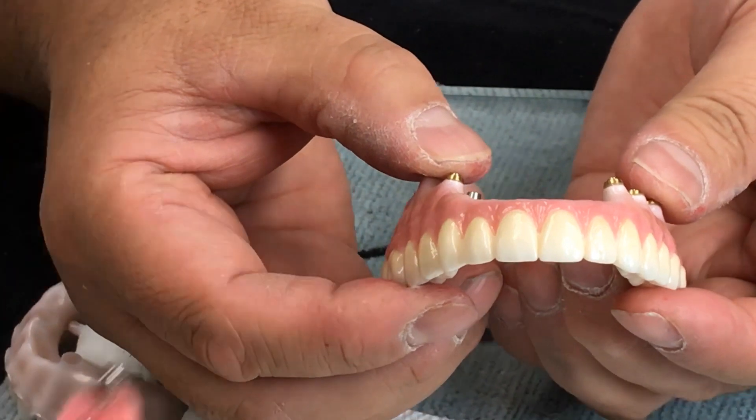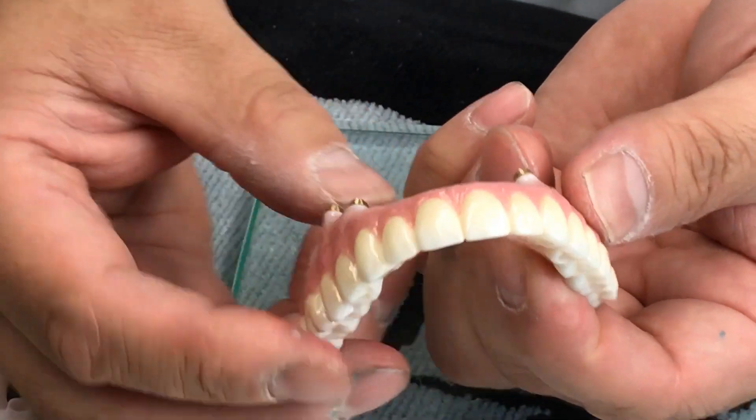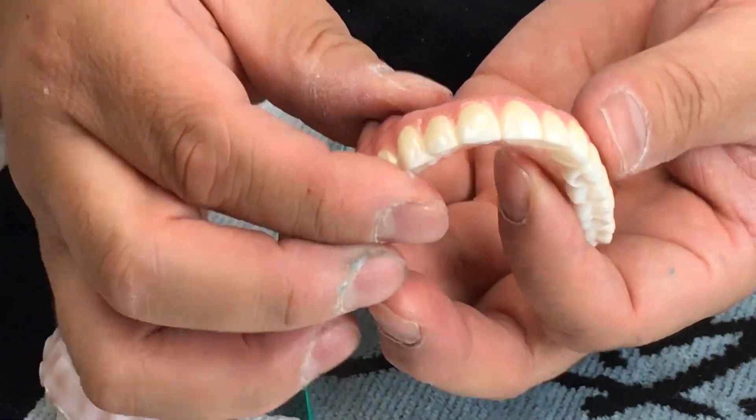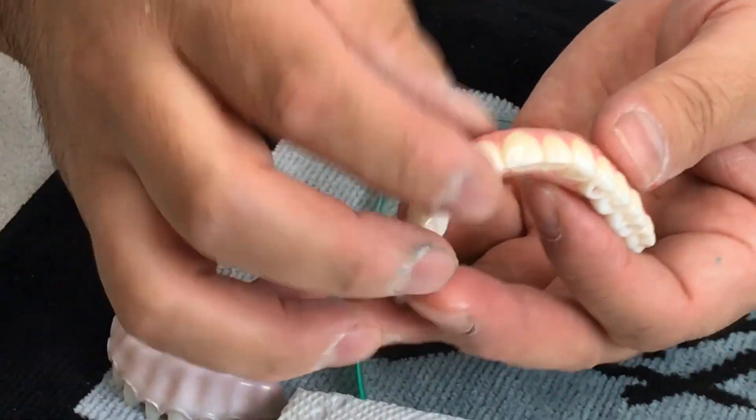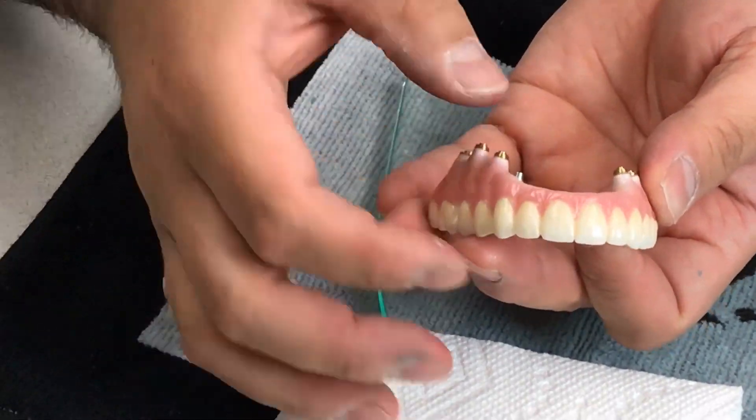Since this is dental wax, unfortunately we have to make it as thin as possible here, but then we also have to make it thicker in other areas. So the first step is to mill the base part — the tissue and the implant component part.